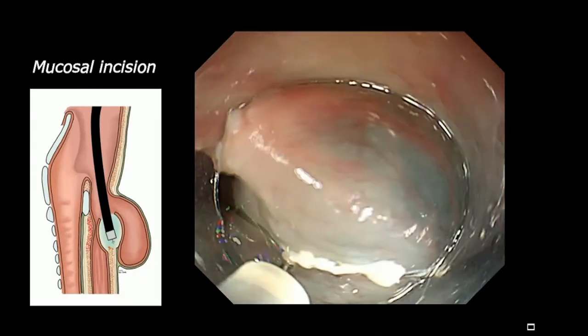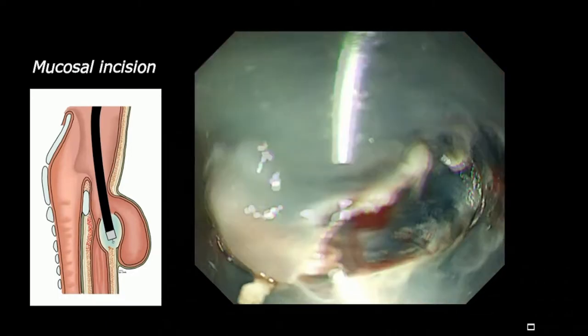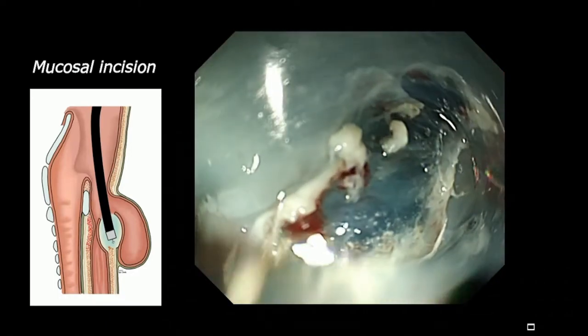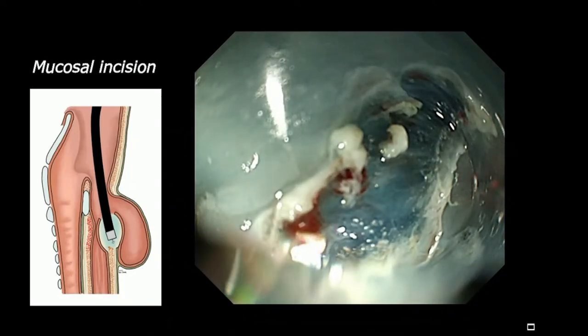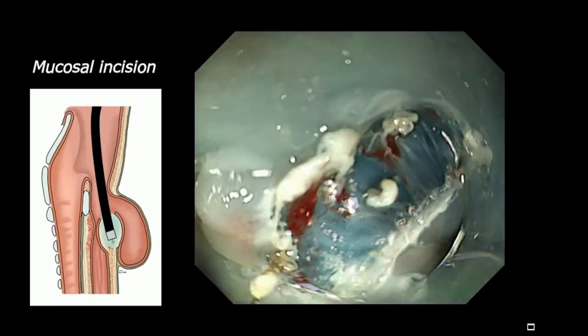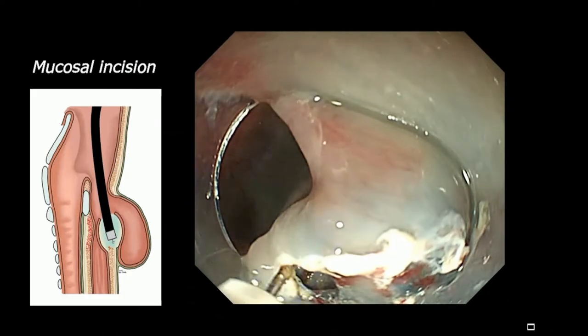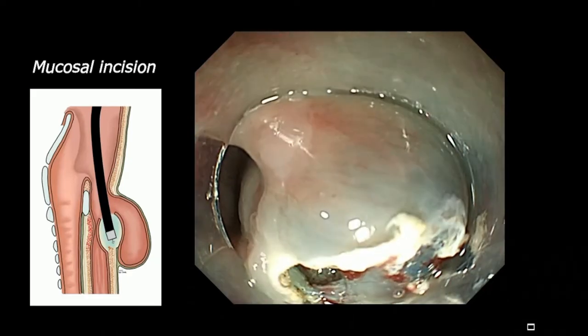There is discussion about whether we place the horizontal or longitudinal incision, but that doesn't matter. Anyway, a small incision that allows the endoscope tip to pass. Now we are dissecting these submucosal fibers.